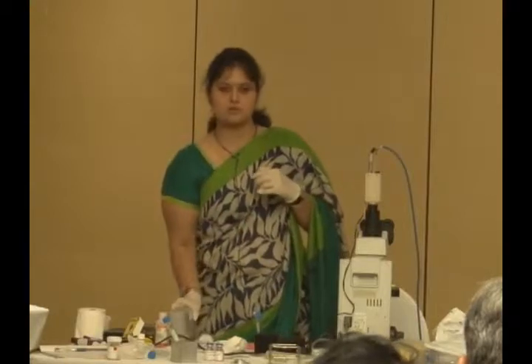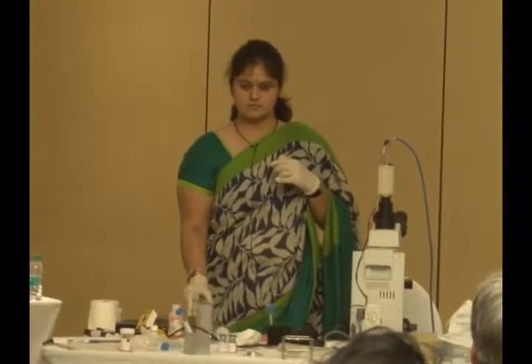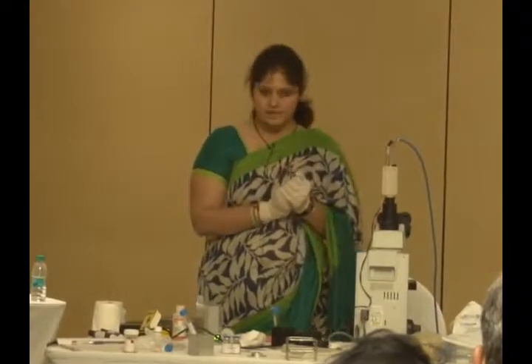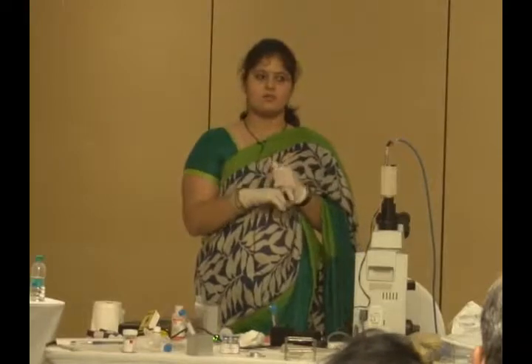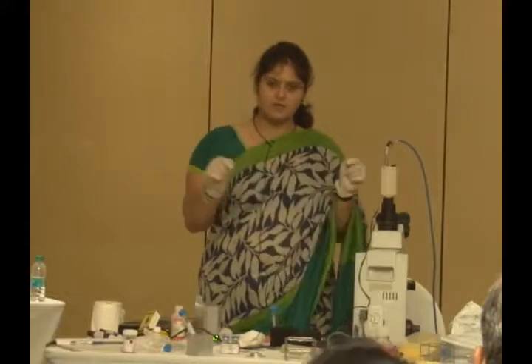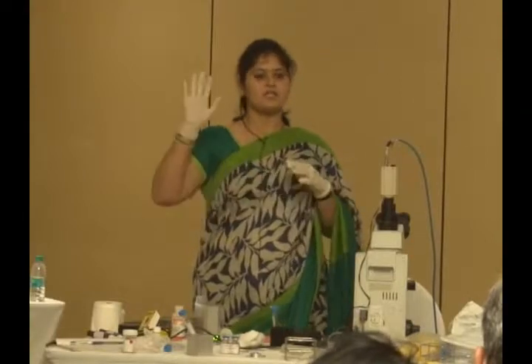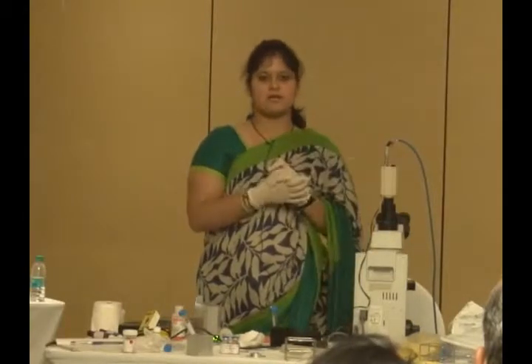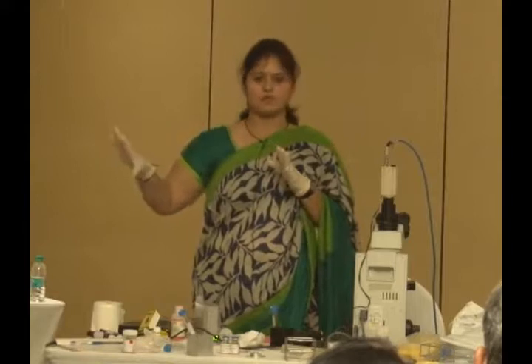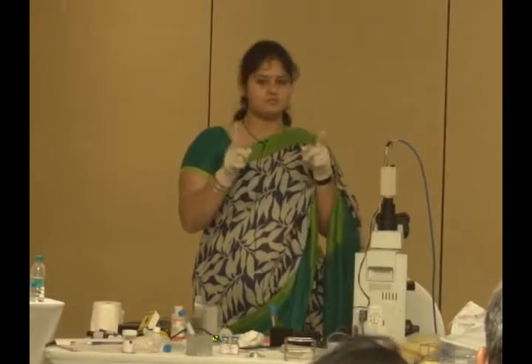Heating block, yes, this is a heating block. It provides 37 degree temperature. Mini incubator, I mean, this is just for the temperature. For gas, you would have to buy separately, but if you are doing IUI it is not required because most of the mediums used in IUI are HEPES buffered. So you don't require the conventional CO2 incubator, but you can use a normal incubator. But keep the incubator separate. Don't mix it with the microbiology lab. So when you're doing IUI, you put a separate setup for that. That is better. And you have to process the sample within 1 hour.